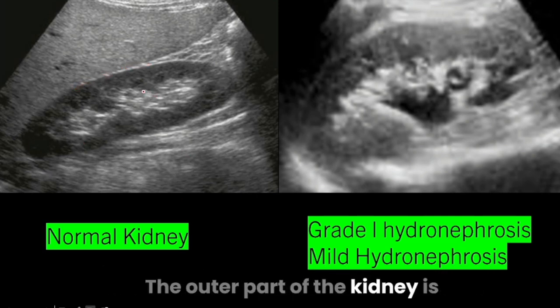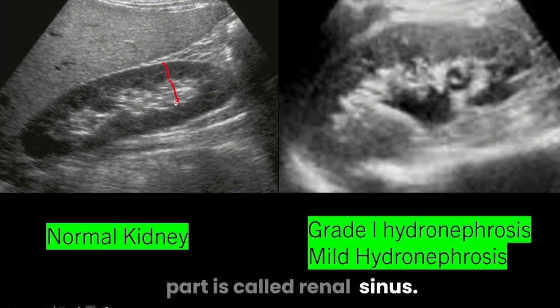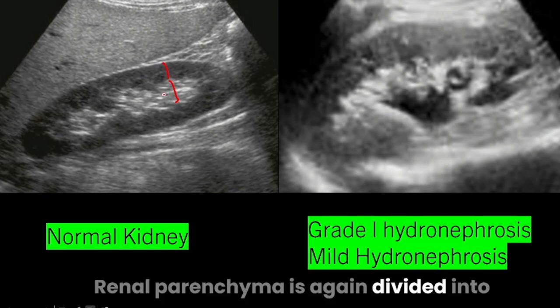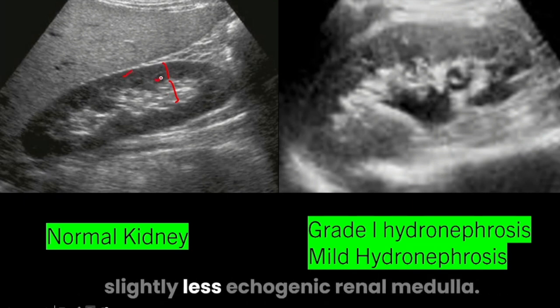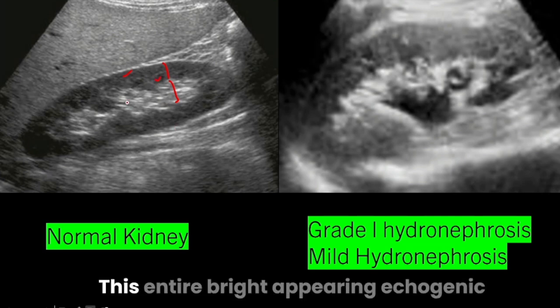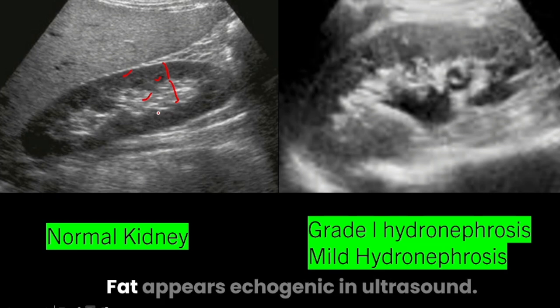The outer part of the kidney is called the renal parenchyma, and this inner echogenic part is called the renal sinus. Renal parenchyma is again divided into the outer, slightly hyperechoic renal cortex and the inner, slightly less echogenic renal medulla. This entire bright-appearing echogenic part is the renal sinus. Renal sinus appears white in ultrasound as it contains fat. Fat appears echogenic in ultrasound.